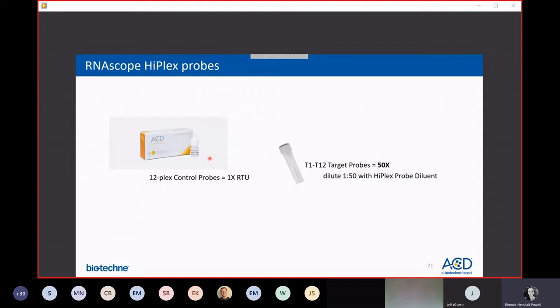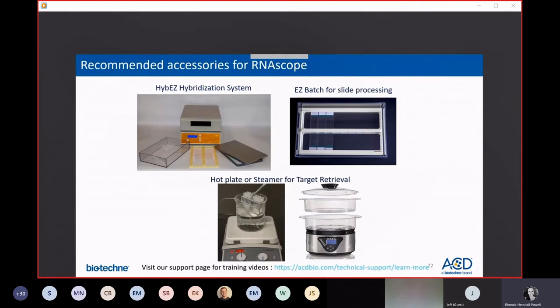This is basically a buffer to dilute your concentrated target probes 1 to 50 for application to the slide. Again, most of the kit reagents come in these little dropper bottles. It makes the kit so easy to use. The one thing you'll really need the pipette for is to do this dilution factor.